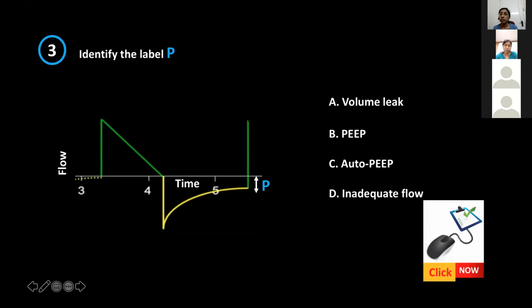Okay, Dr. Tenson, how do you measure intrinsic PEEP? Though we might discuss it in subsequent modules. Sir, actually, any PEEP we have set on the machine, we have to make the PEEP 0, and then we do an expiratory hold for 2 to 3 seconds. Okay, like we did the inspiratory pause for plateau pressure. This is expiratory pause.